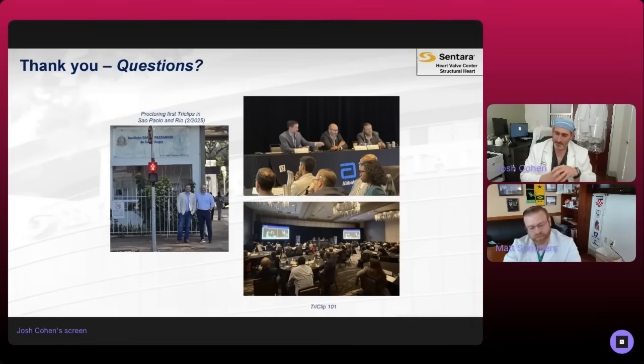Yeah, well, really appreciate you doing this as well. I think from a standpoint of these therapies getting rolled out, the way that the results are safeguarded with all tricuspid therapies is really an attention to detail that you garner from advanced imaging.